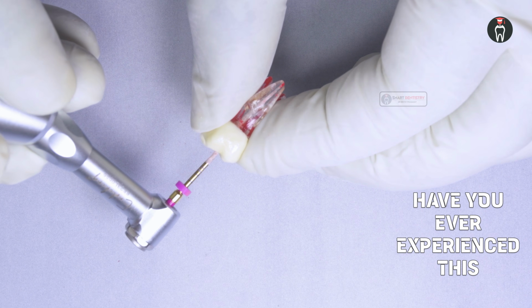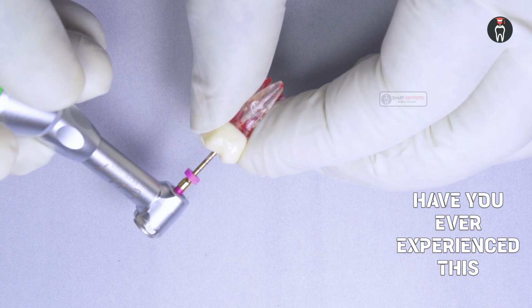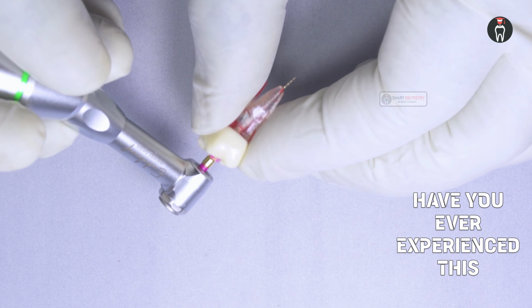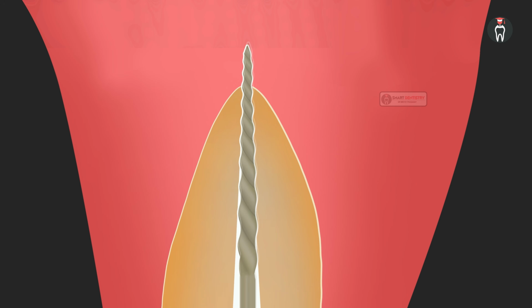Have you ever experienced this? When we are doing cleaning and shaping, without our intention, the file gets screwed inside the root canal and probably goes beyond the apex. Yes, this unintentional extrusion of the file, or the file getting sucked inside the root canal by getting binded or screwed, probably goes beyond the apex and that could cause postoperative pain and violate the apical foramen.